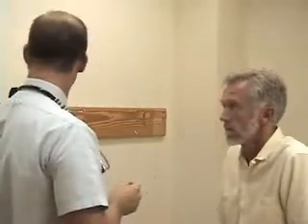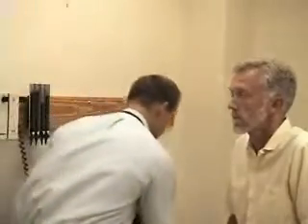Next, I'm going to do the ophthalmoscopic exam. I'm not going to dim the lights here so that you can see what I'm doing, but while you're practicing in your group, you may want to dim the light enough so that the patient's pupils can dilate a little bit to make the exam easier. I'm going to dial the light intensity down on my ophthalmoscope so that the patient's pupils will constrict a little bit less. I'm going to leave my glasses to the side — those of you who wear glasses may find it easier not to wear them so that you can get your eye closer to the lens on the ophthalmoscope.